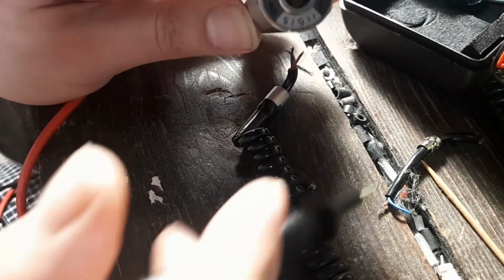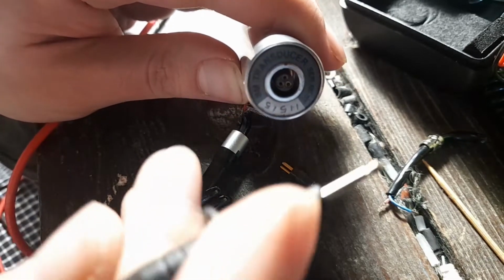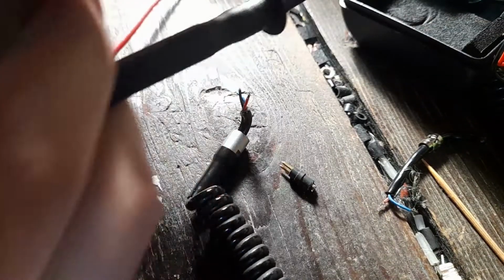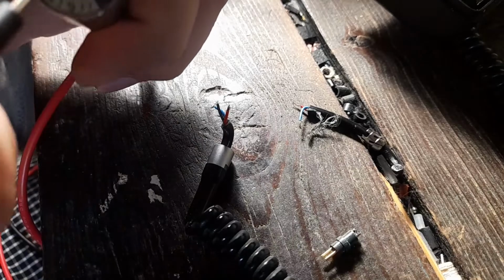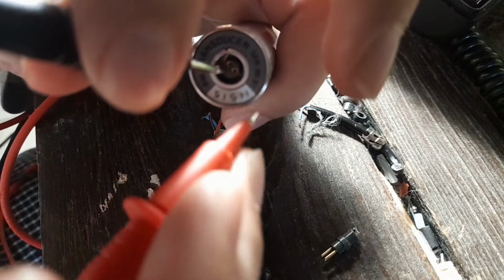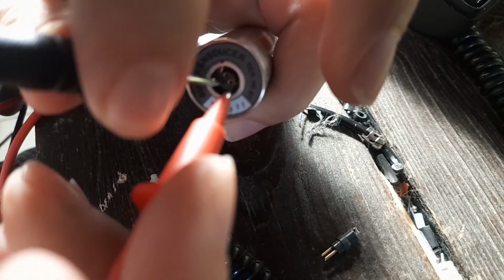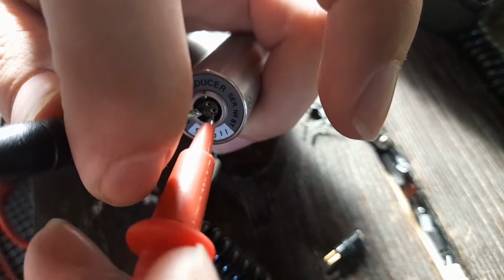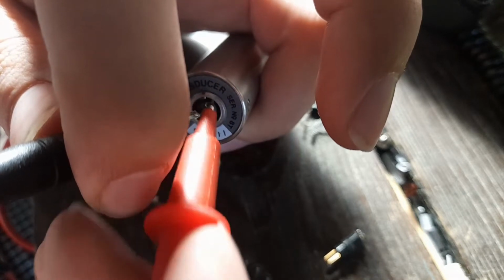So now I have to find out where the cable goes into the connector. It's a Lemo connector, so it's shielded, and because the ground is short-circuited in the board with the shield, the easiest signal to trace is ground. So you can see here, we know this is ground, this is the connector. The other 2, one is the power line, and the other is the analog output, the audio output from the sensor. I assume that this is the analog output. Why? Because it has the point for the Lemo connector to work.